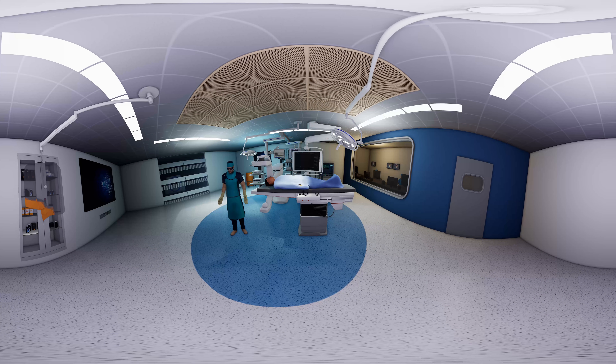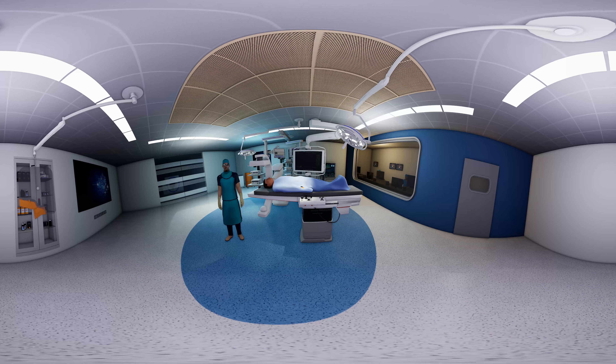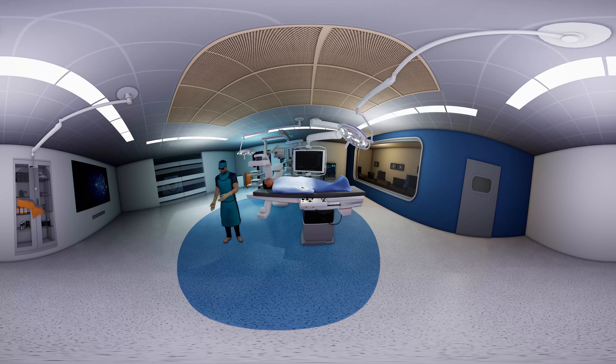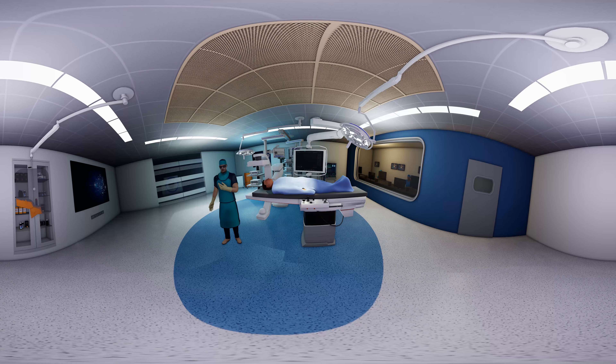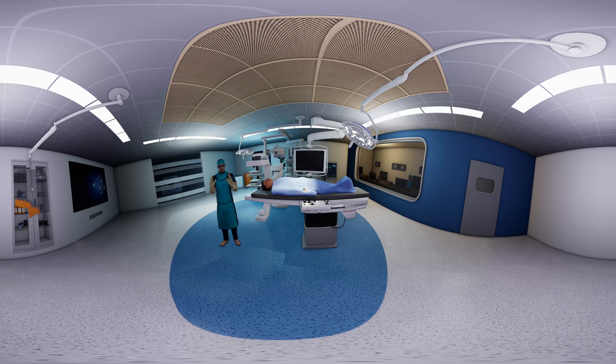This is my apron — a vest and skirt model with an ergonomic fit designed to distribute the weight, reducing the strains. Sleeves can be integrated to protect the shoulders and mammary glands, and these are sterile x-ray protective gloves on my hands.